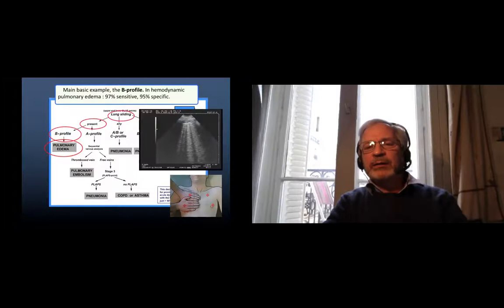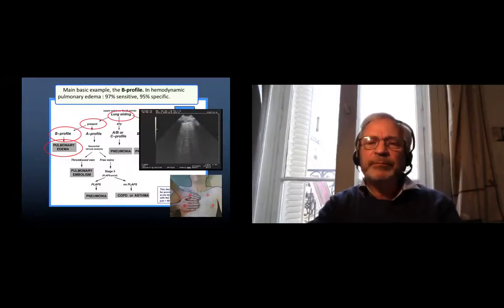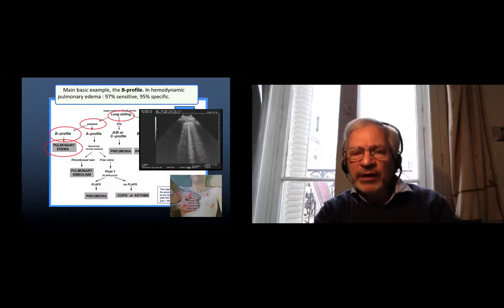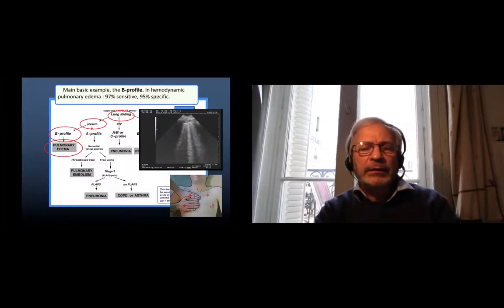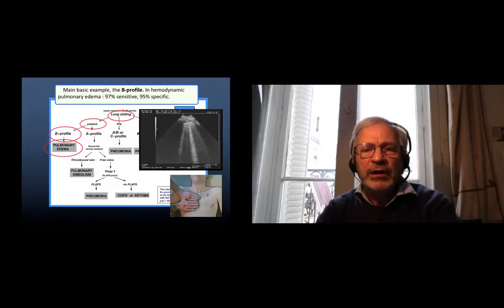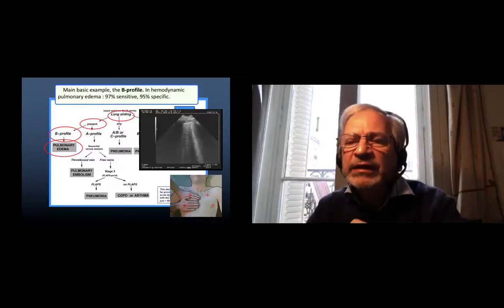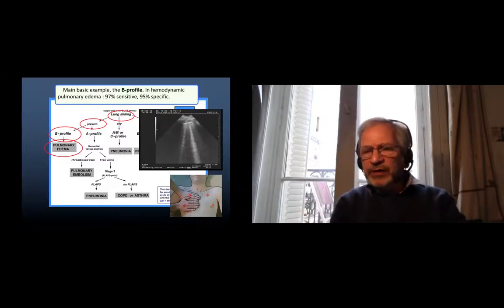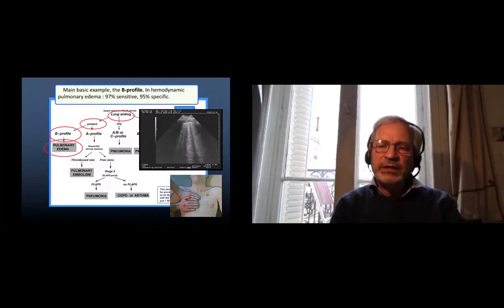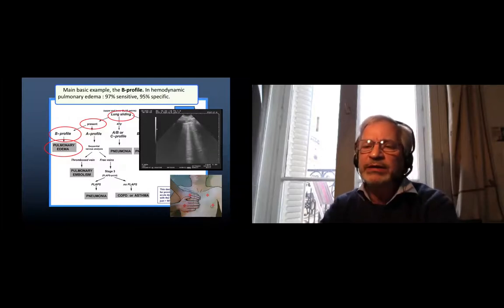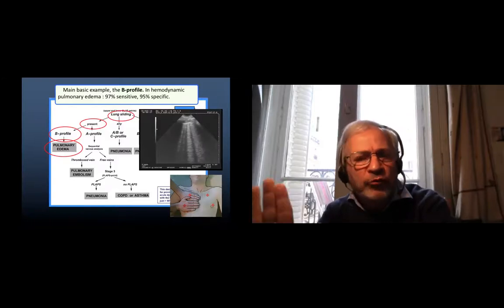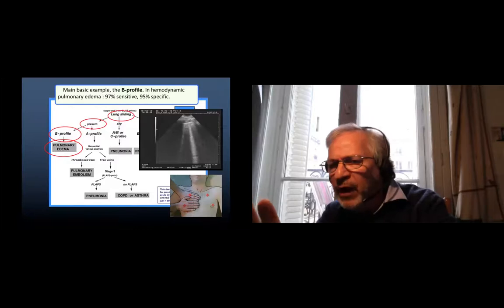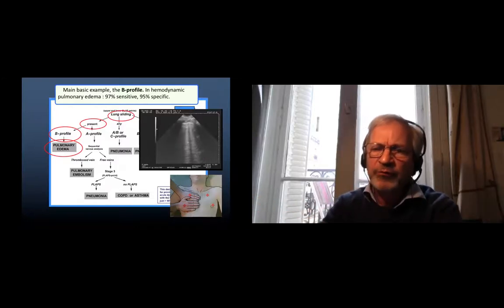The B profile: is lung sliding present at the four anterior points that we will see a bit later, associated with lung sliding? And we are obliged to add I don't see any anterior consolidation. This is the B profile. It is 97% sensitive, 95% specific to hemodynamic pulmonary edema. I can see here more than two, for sure maybe four, maybe five B-lines moving at the four anterior points.